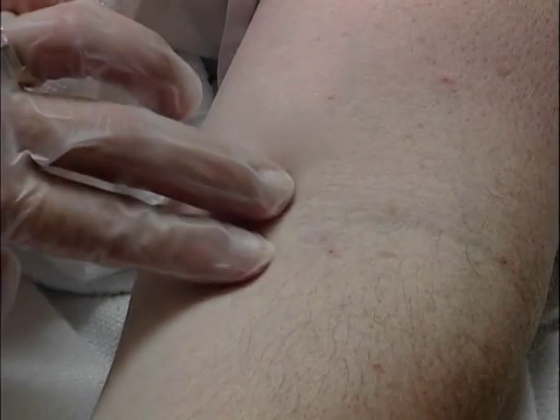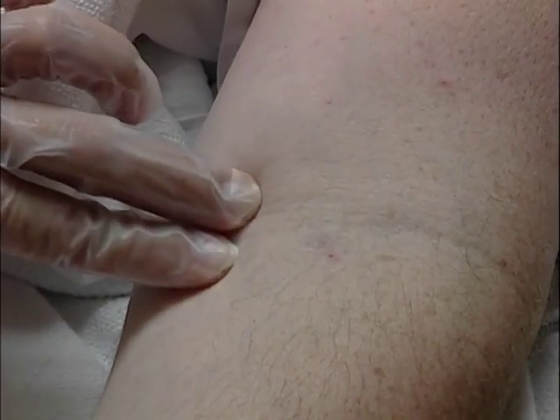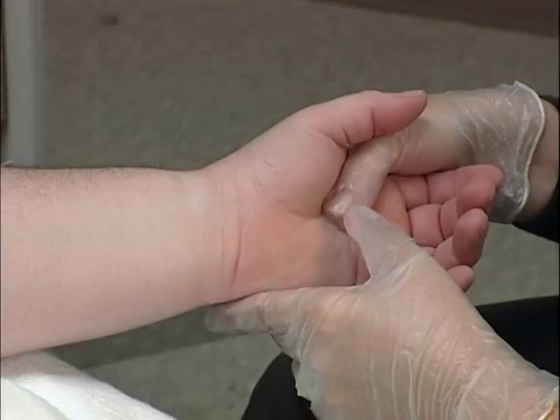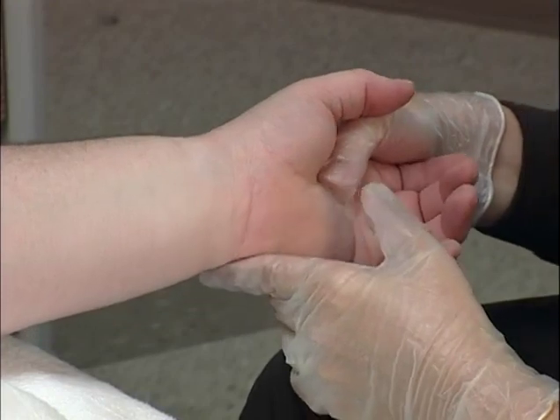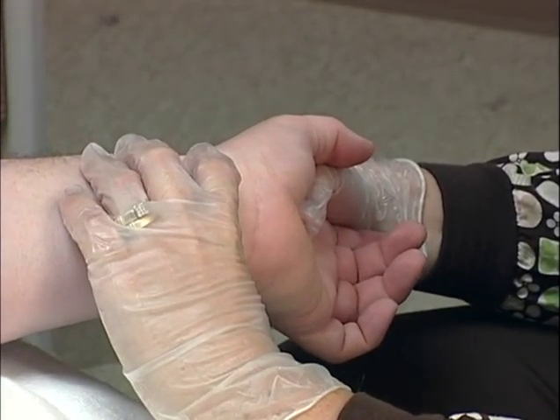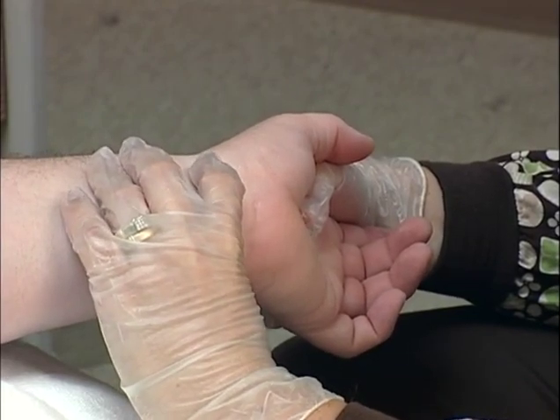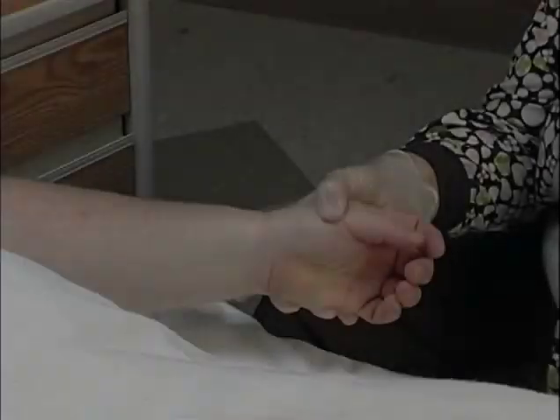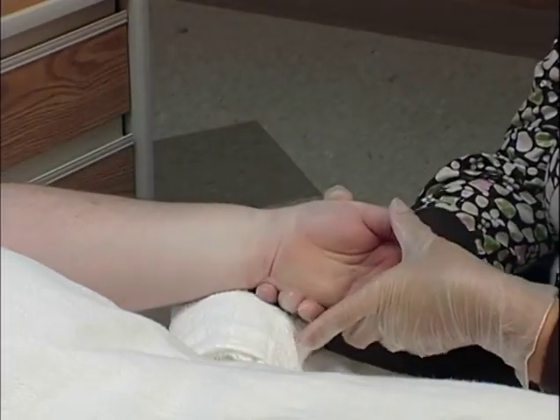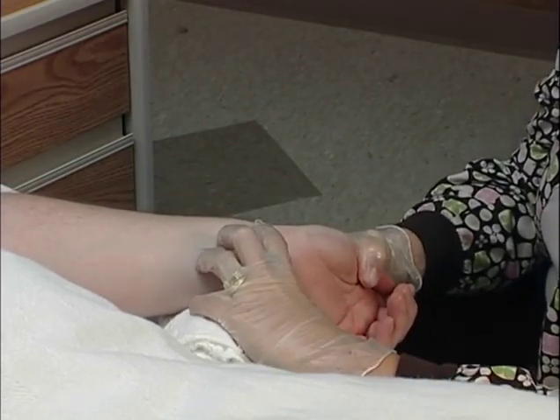If an acceptable radial site cannot be located, palpate for the brachial artery on the inside aspect of the upper arm. For radial draws, hyperextend the patient's wrist if possible to more securely position the artery closer to the skin's surface and to tighten the skin for easier needle insertion. For patients who are unconscious or cannot assist, hyperextension may be accomplished by positioning a rolled towel under the lower forearm.